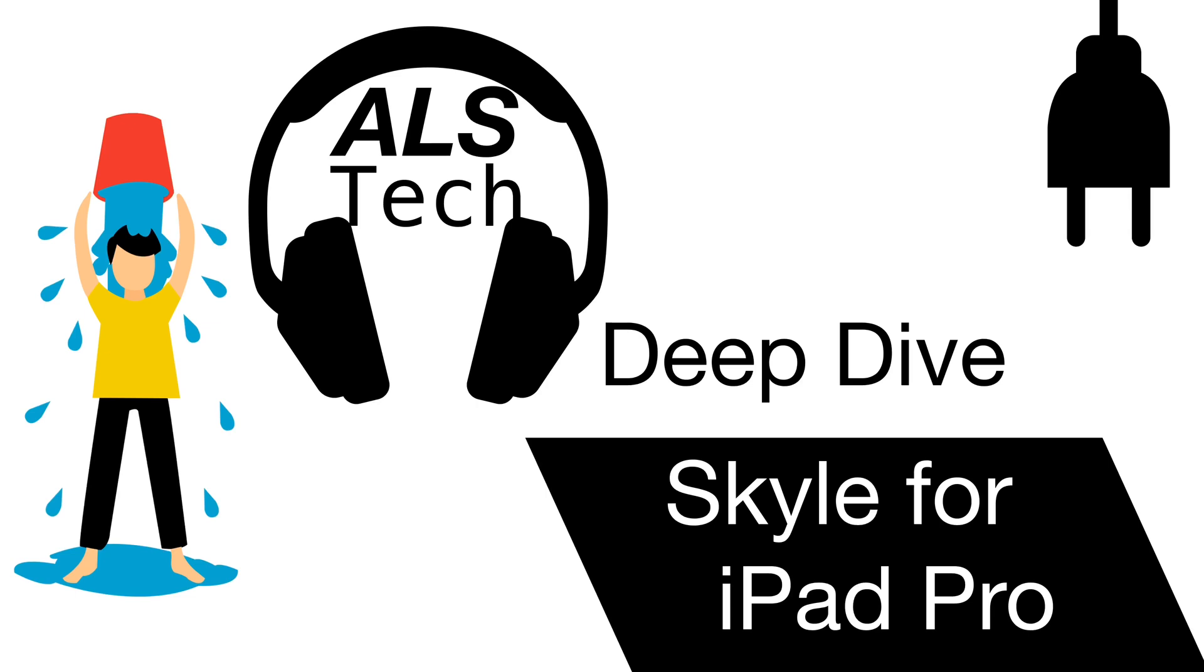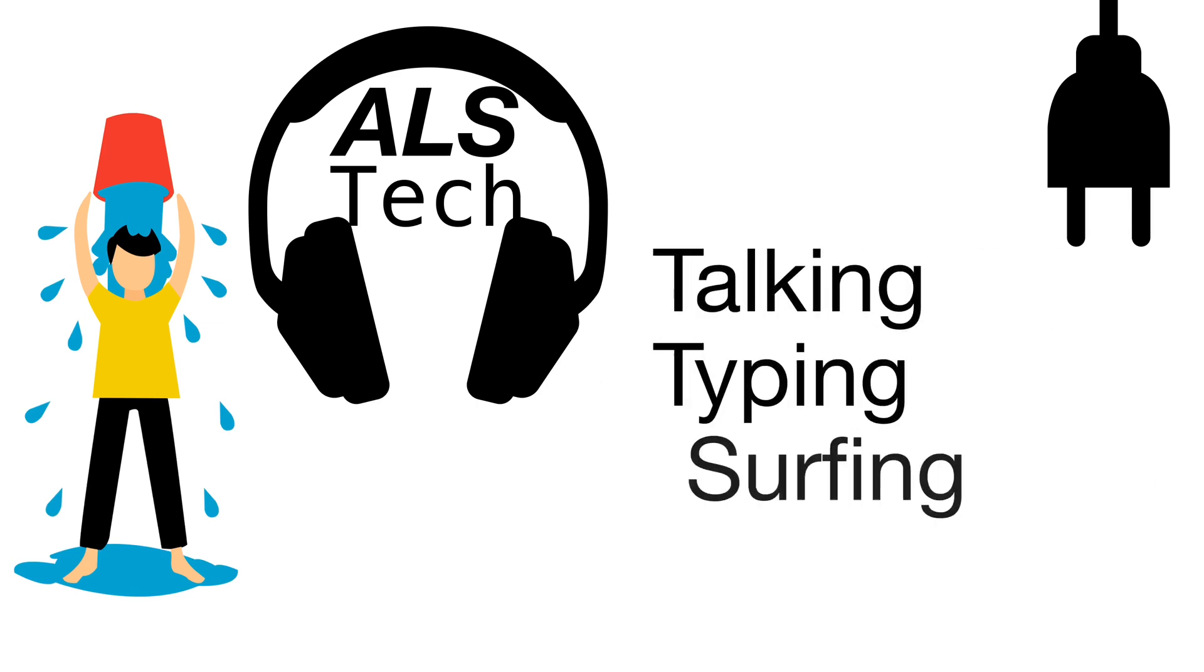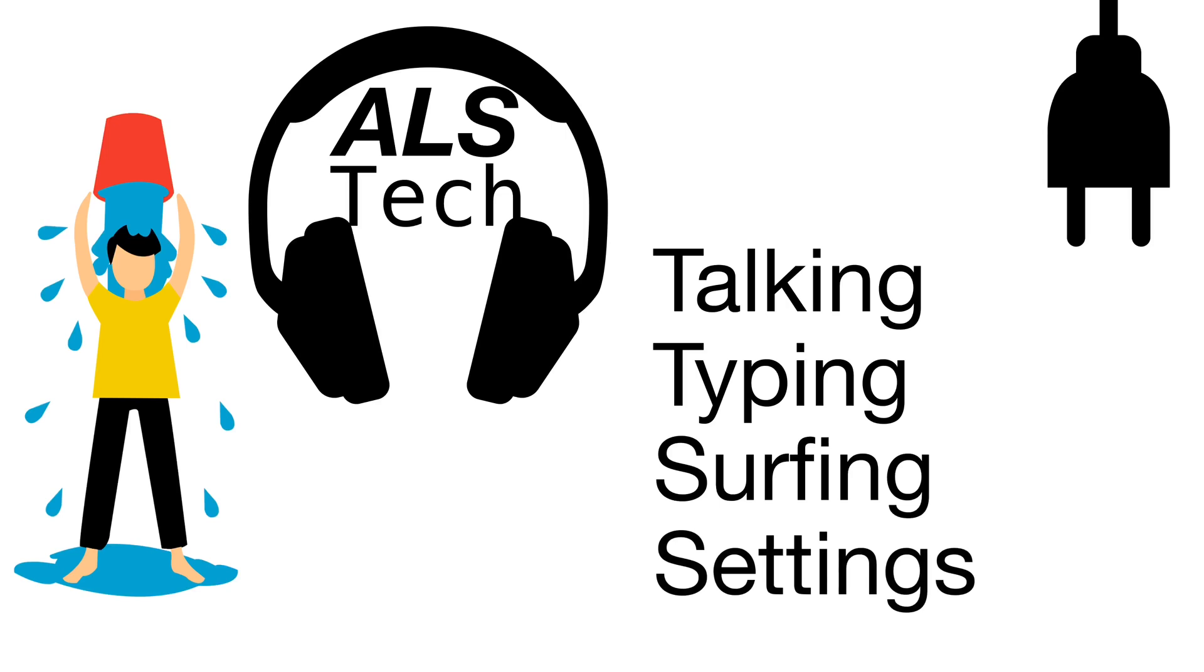Based on comments from my initial review of the Skyle, I am going to take a closer look at talking, typing, surfing the web, and settings that make the Skyle easier to use.